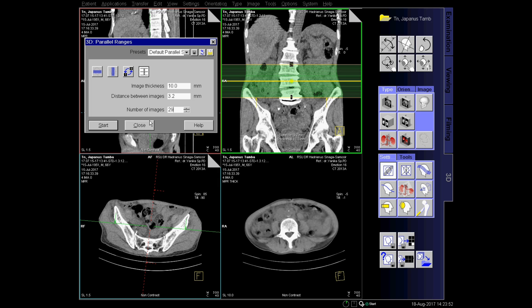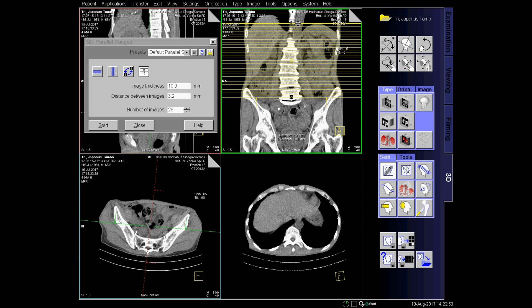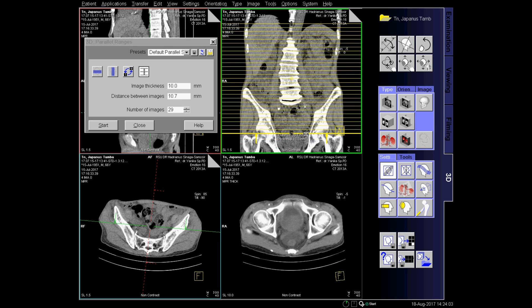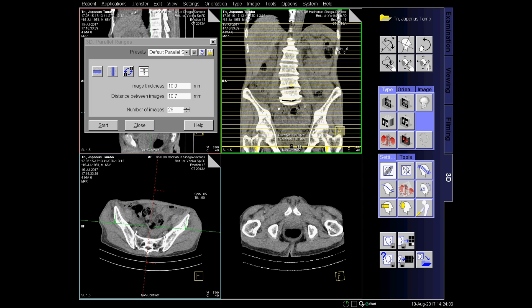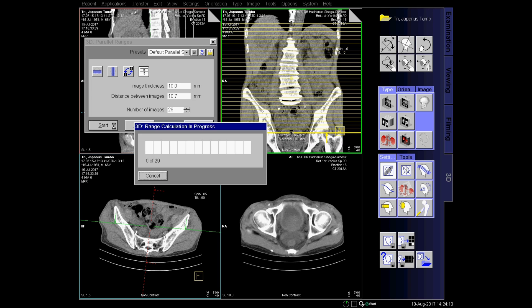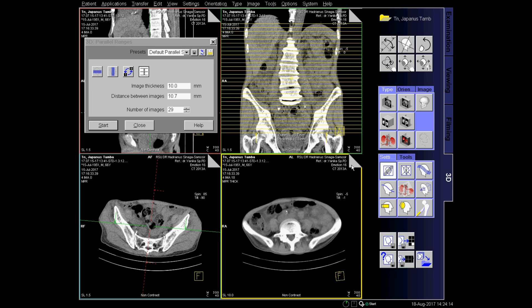Reconstruction of the cutout. The first one we make is the axial cut. We set the parameter: image thickness equals 10mm and number of images equals 29. Then we set the upper limit and lower limit, and the cutout image that we want to reconstruct. After that, we start to process the image into image data according to the parameters we have set. Then we save it for later entry into the filming menu.